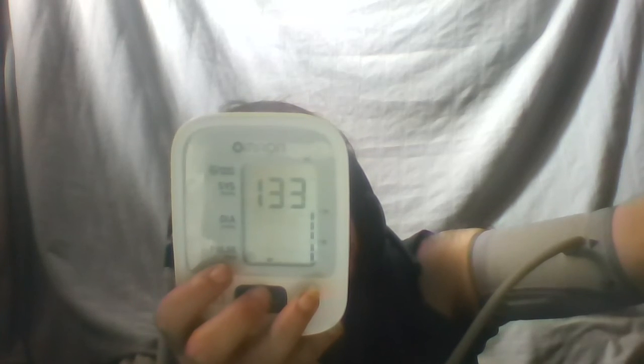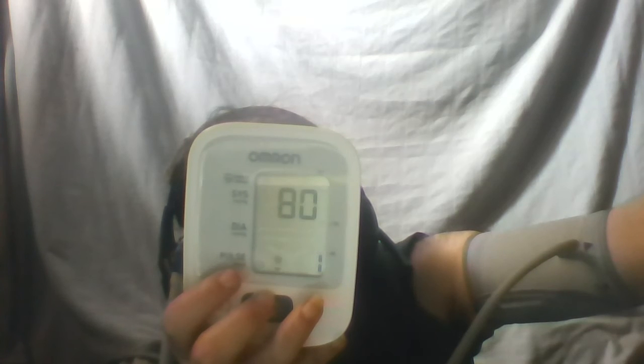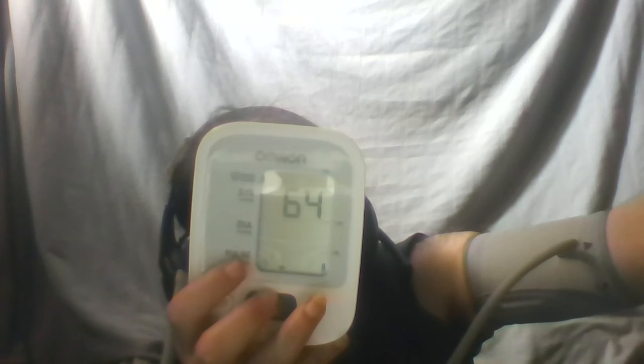It's making a noise — it's tightening my arm. I can stop at any time by pressing that button, and I just have to wait for the little black dots to go down. You're not meant to talk while doing this. Now it's loosening.